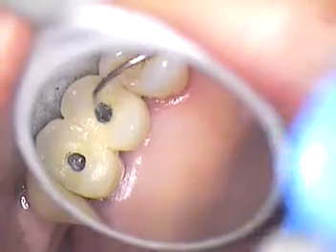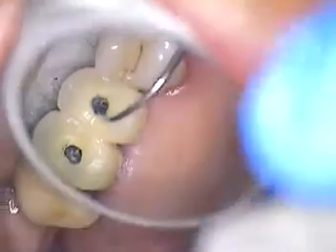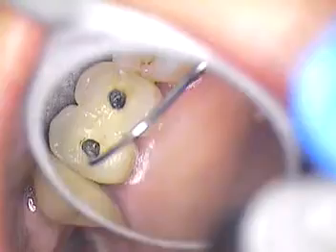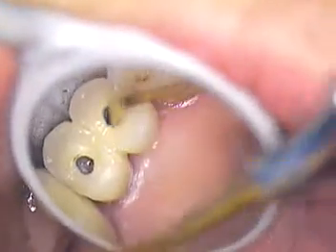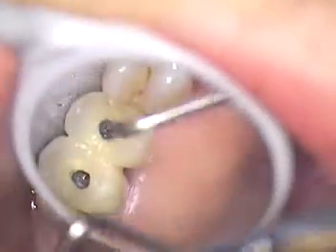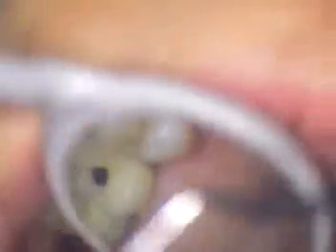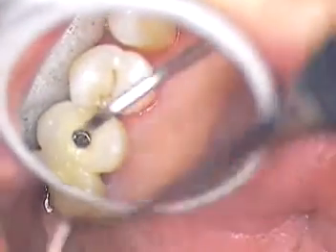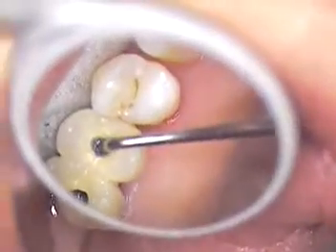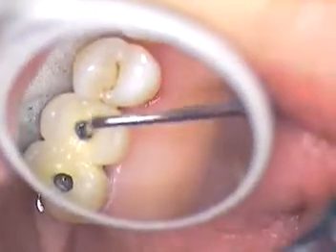We were discussing access and how to approach this. The name of the game is just slowly. Now I'm going to see if we have a flat instrument — that's too wide. We'll go with a smaller one. Maybe that's too wide too. Now we're going to go with a hollowback, which seems to be perfect. We'll turn that — there it goes. I think I almost got a full turn.